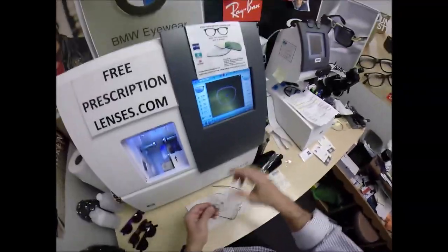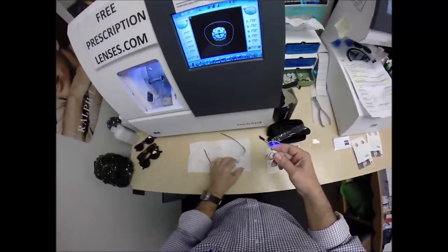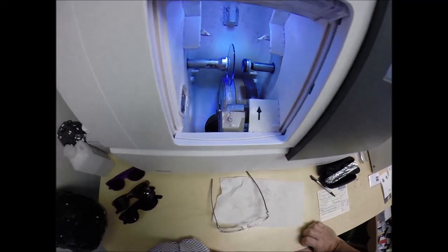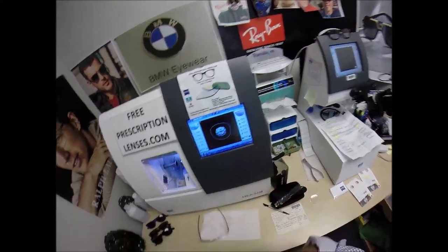And let's go ahead and come down here, flip this over to L, which is Latin for not right. Place the magnet into the chuck, the Charles, the Chucky baby, the Chuckorama. That's my homage to Rob Schneider. Or today I'm calling it the Robert. Hit the green start button.